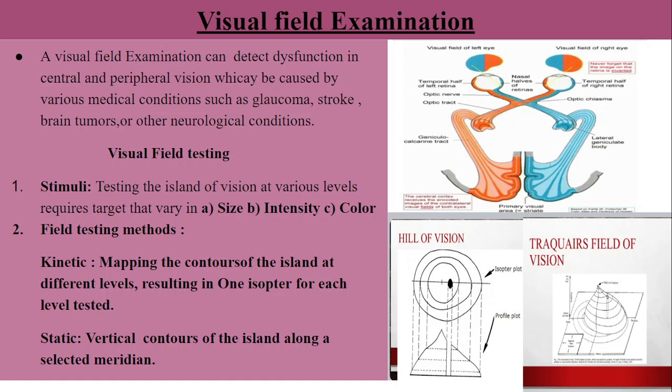There are also other types of visual field testing modes, such as frequency doubling technology and multifocal electroretinography, which are used for more specific diagnostic purposes.